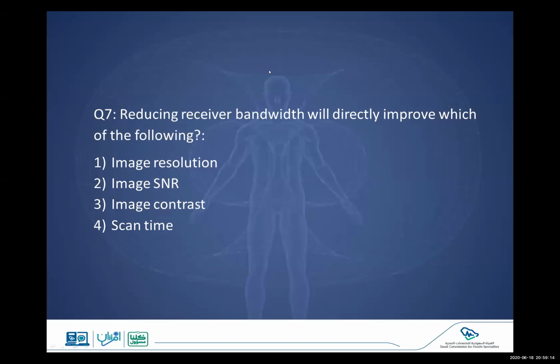Image contrast has nothing to do with it; it's not actually improving your contrast. Scan time, again, is not directly affected. I should mention "directly" because sometimes it can be affected by increasing the number of slices, but directly it's not affecting your scan time.